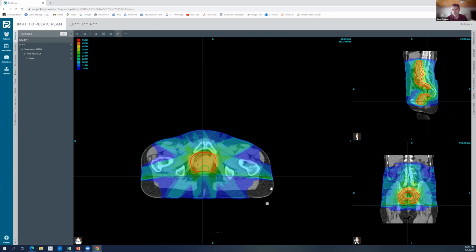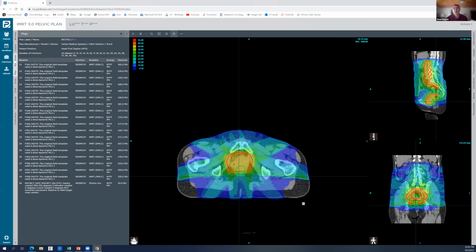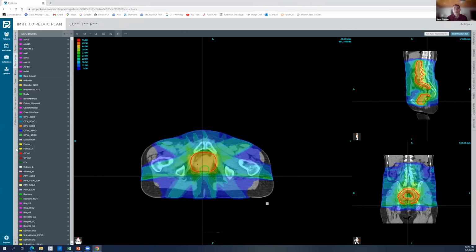I don't know, do you want to add to that, Eric? I mean, VMAT chest walls aren't a common occurrence unless you have nodes or something. But to account for the breathing, and that may be one of the reasons why we typically don't, is because you do have the motion if it's a free breathe with the chest wall anatomy coming in and out of the beam. You never know where you are each time. Unless there was some way to monitor a true breath hold, it would be difficult to do. So not to say you shouldn't do it, but we probably wouldn't do it unless we had the capability to do a breath hold. Just our suggestion.